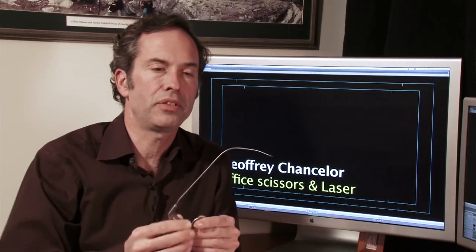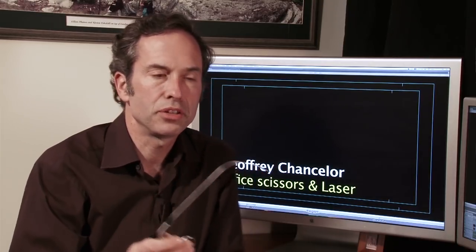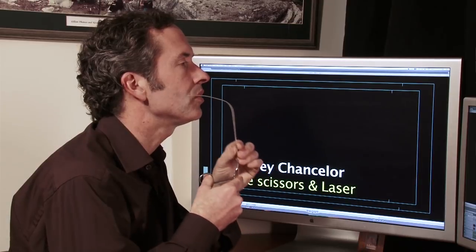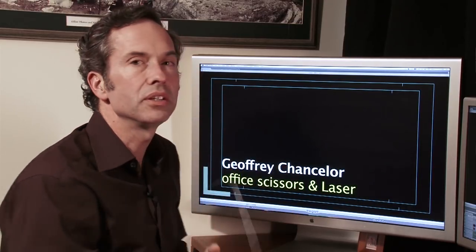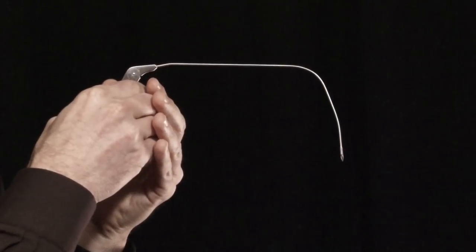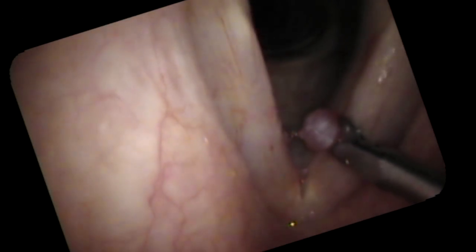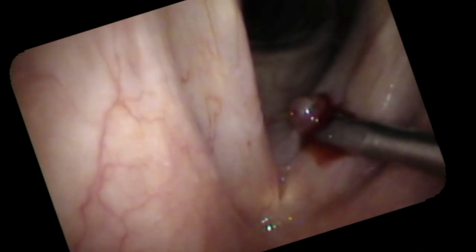We're going to use a pair of scissors that have been modified — operating room scissors with a bend in them. I can pass a camera through his nose, put the scissors in his mouth, go around the corner, and operate cutting down on the vocal cords. His polyp is a fairly big one in the center of his vocal cords, giving him diplophonia, air leak, and a very rough voice. Here we are in the office with a flexible camera looking down and cutting off the hemorrhagic polyp.